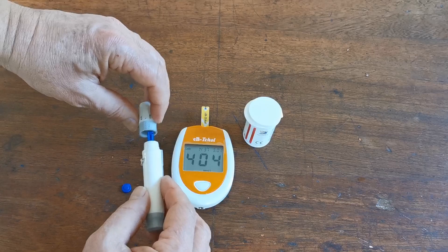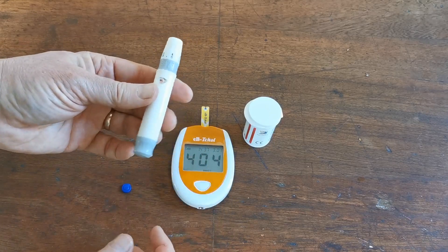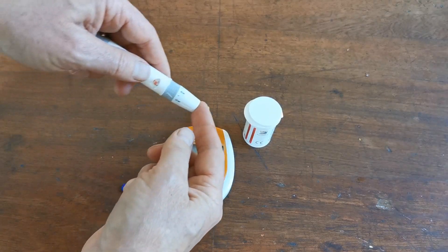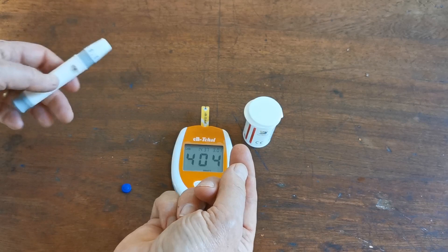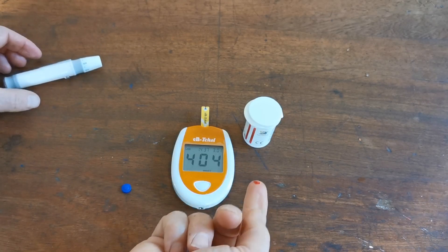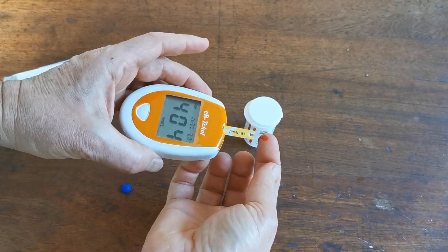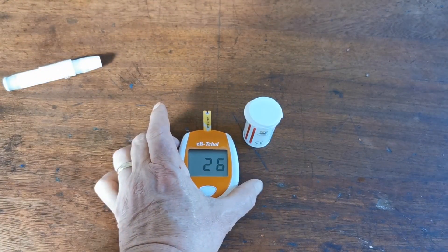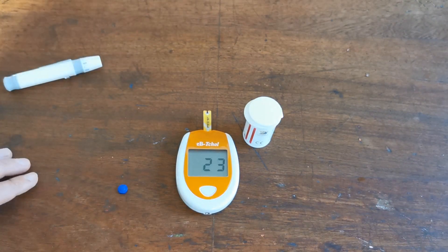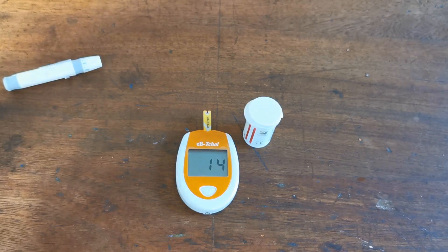Unscrew the lid of the lancing device and insert a fresh lancet into the auto lancer. Remove the cap and the lance is exposed. Reposition the cap and set the depth — I'm going to set this to depth 5. Pull back on the spring and you're ready to take your blood sample. Place the lancing device firmly against the pulp of a warm, well-perfused finger and release the lancet. Allow a blood sample to form naturally, and when you've got a good droplet, present it to the tip of the test strip. When an adequate supply is presented at the very end of the test strip, it will trigger the device. If you have to keep feeding blood in and it's not triggering, then the lance was inadequate and the sample too small.